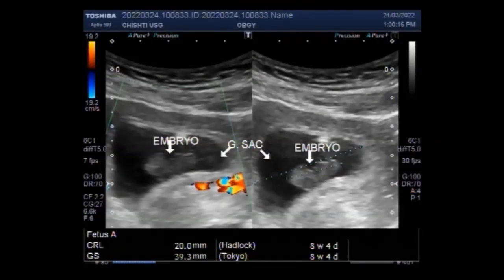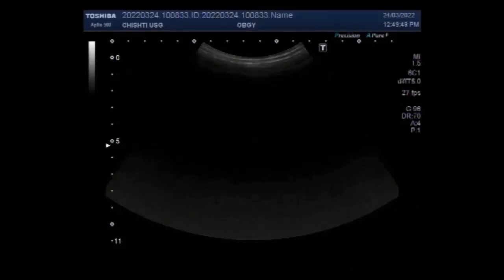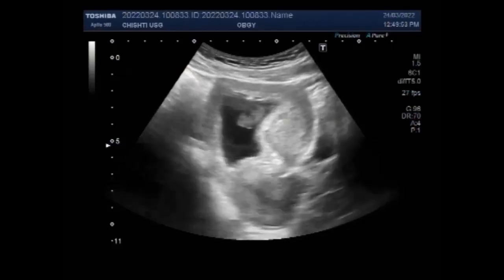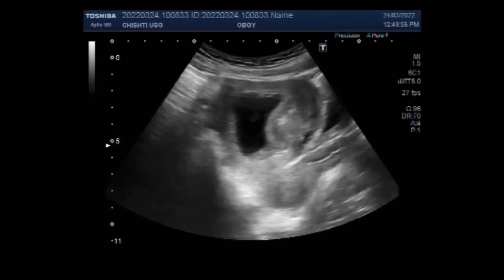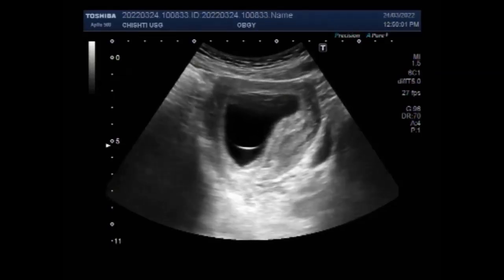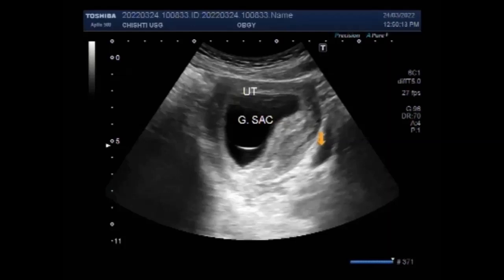Dear viewers, I hope you are all fine. This ultrasound video shows a case of missed abortion, also called missed miscarriage, with a pregnancy of about 8.5 weeks. You can see the uterus having a single gestation sac, and an embryo is visible inside this gestation sac. However, fetal cardiac activity is not visible and fetal blood flow is also absent.